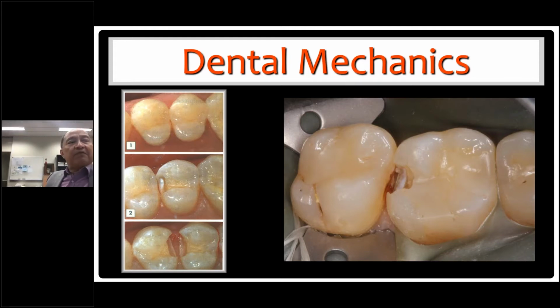Well, my professional life started with amalgam. It moved on to hand-mixed composite resin, then light-cure composite resin, then glass ionomer cement came along. And glass ionomer cement, I would say, has a lot of disadvantages, but it also has a lot of advantages. My job tonight is really to illustrate to you when it is best to use glass ionomer cement. It's not a substitute for composite resin, but there are situations where only glass ionomer cement would work.